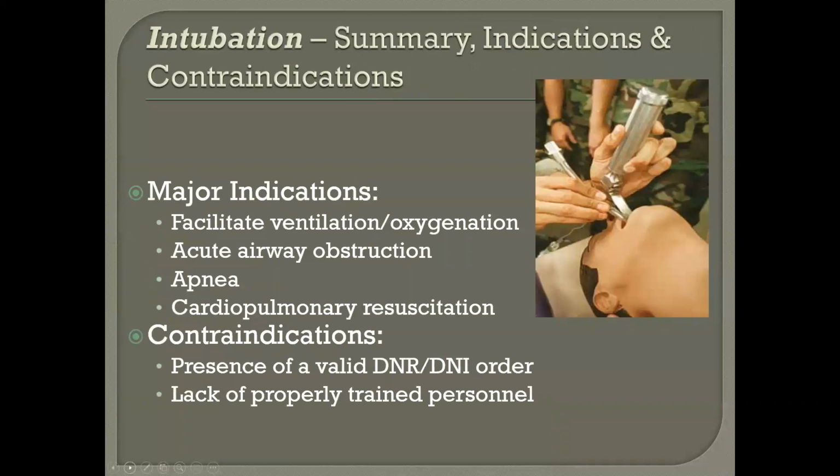Intubations, let's start there. This is kind of serendipitous because yesterday we actually had one of our competency days for our respiratory department, and this was my station, intubation, and we got some new equipment. So it was partly on intubation in general.